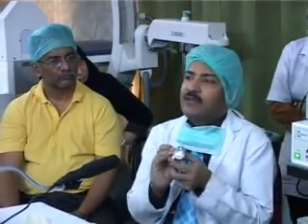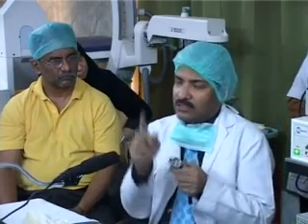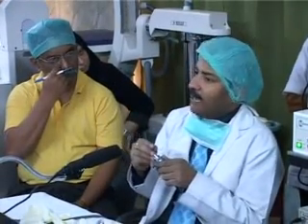If the instrument is inside, then it will not leak, but once you have taken the instrument out, it will start leaking from this valve. So this is the second point where leaking can happen.